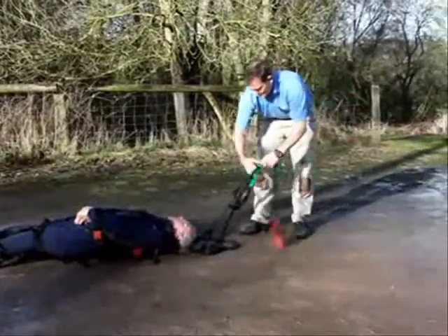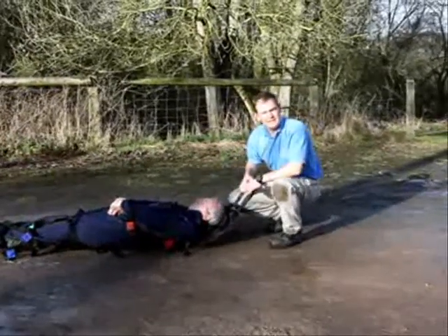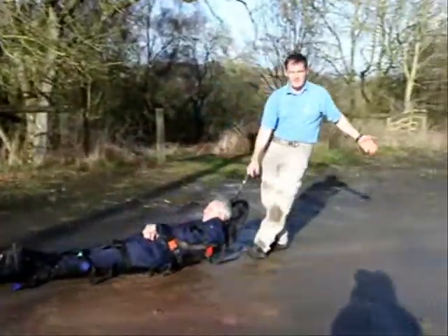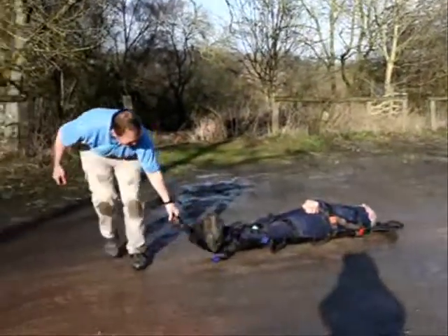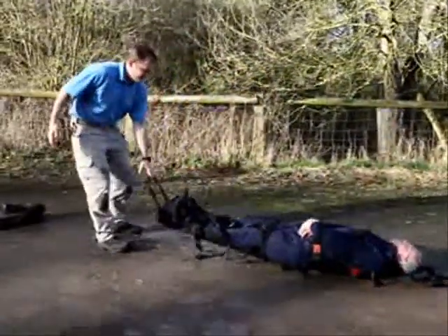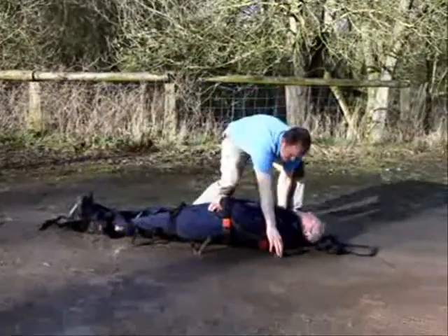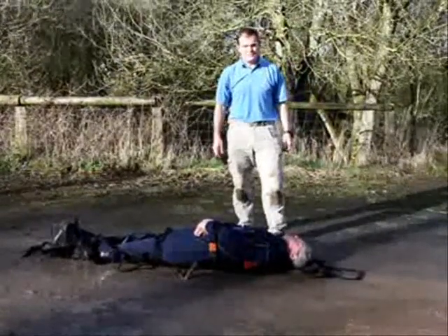As well as this towing strap that you've seen already, the teammate has a handle at the top and the bottom. So you can drag the casualty very easily one-handed from either end if necessary, and that's not much effort at all. The teammate also has handles down either side — three on each side — so we can carry it more like a conventional stretcher if we have more rescuers.